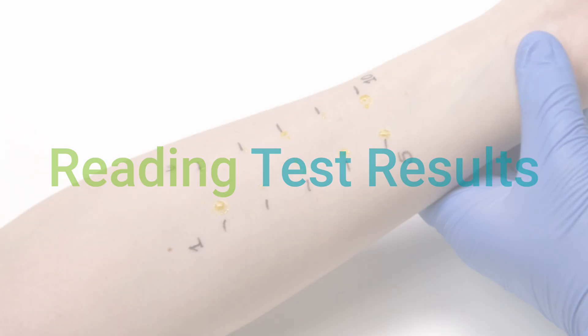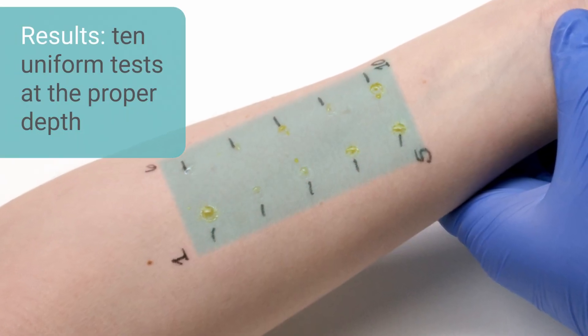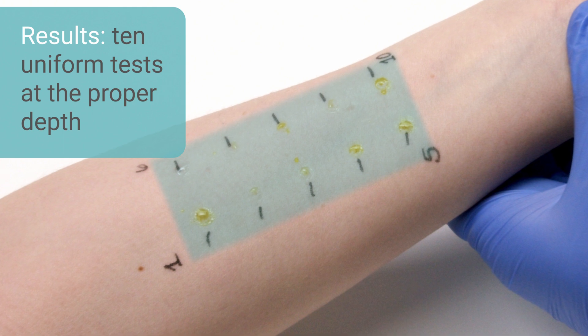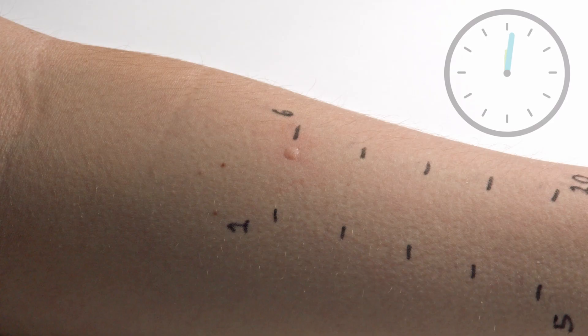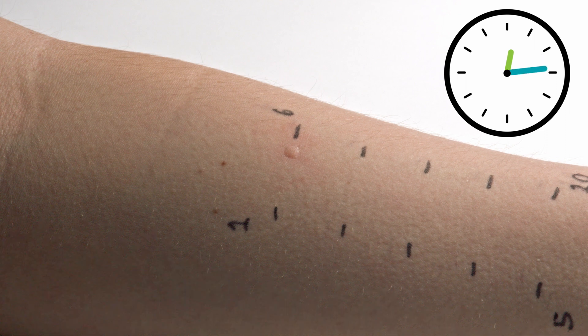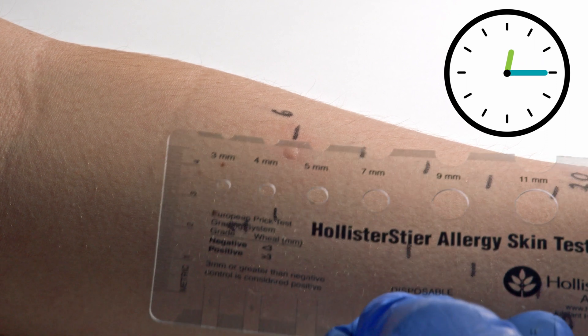When used as described, the Comforten device will produce 10 uniform skin tests, each at the proper depth. Within 10 minutes, the histamine positive control can be read, and at 15 minutes, the allergens are ready to be evaluated.